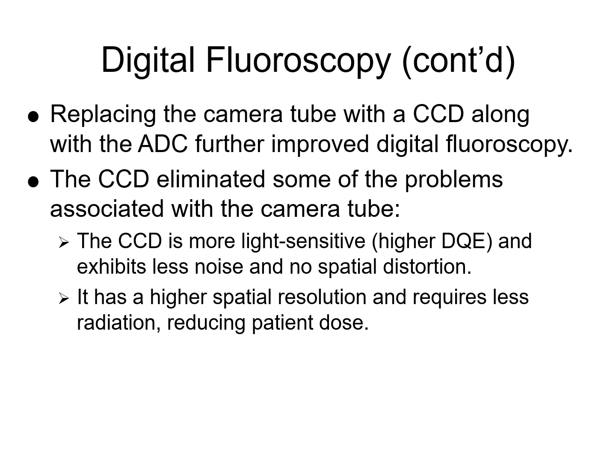Okay? Because it has a higher DQE, that's detective quantum efficiency, it doesn't require as much radiation as we used to need with a conventional television camera. So the amount of stimulation that a CCD needs in order to make a picture is quite a bit less. It's more sensitive to light, and so it needs less light. Well, that means the output phosphor doesn't need to be as bright. Well, that means that the photocathode doesn't need to shed as many electrons. That means that the input phosphor doesn't need to produce as much light. That means we don't have to send as much X-ray. See how I logically deduced backwards?